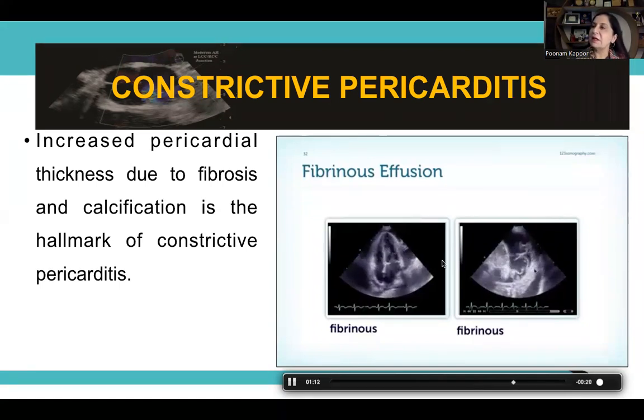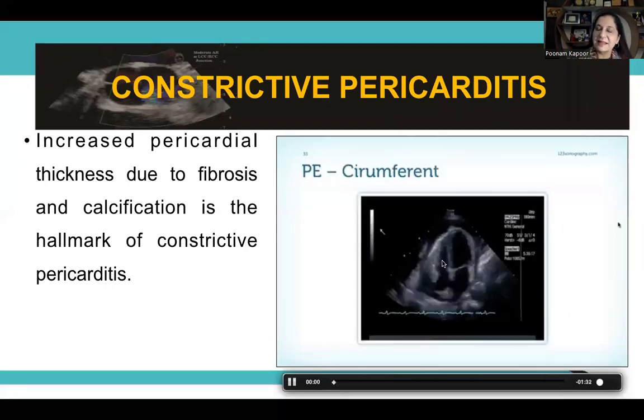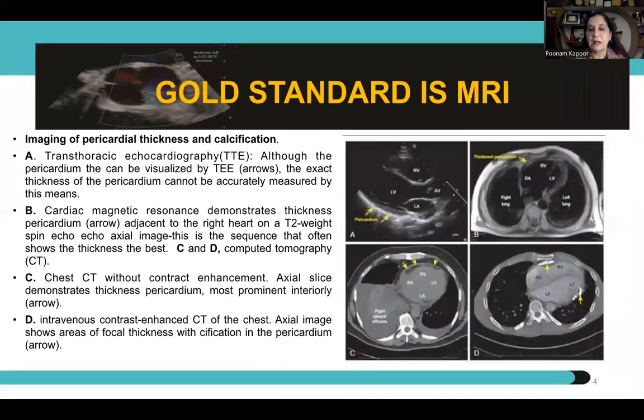And this acute pericarditis remaining neglected has developed into a chronic pericardial effusion, giving it strand-like fibrinous structures around the heart. This mesh kind of system that it forms gives rise to the tamponade that one will have as an emergency, because this patient did not, after the trauma, resort to consecutive echoes to delineate this exudative nature of the pericardial effusion.